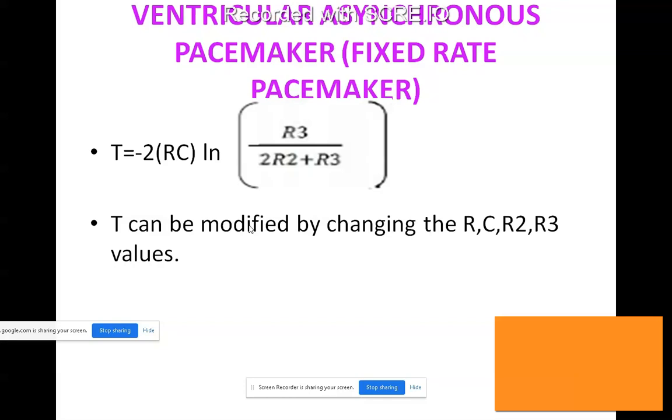There is a generator circuit. Okay, generator means you are not going to use only the generator. In the generator you will have transistors, resistors, etc. Okay, square wave circuit and monostable multivibrator circuit. EC students will know, I think. So a multivibrator is nothing but two transistors connected with the help of resistors and capacitors.